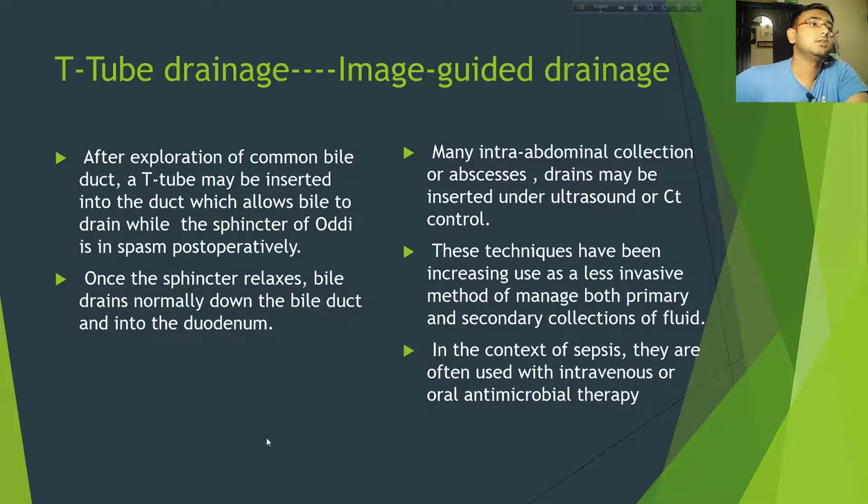Okay, now the image-guided T-tube drainage will be shown to you in the videos also. Okay.